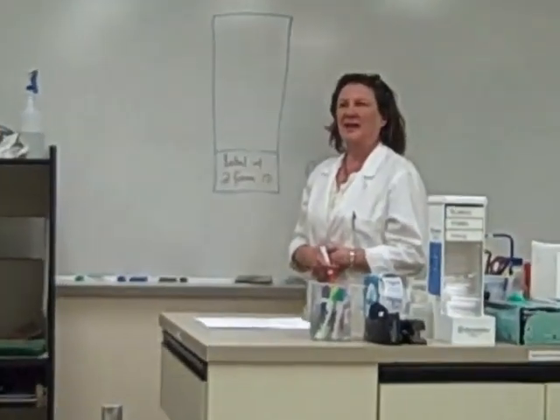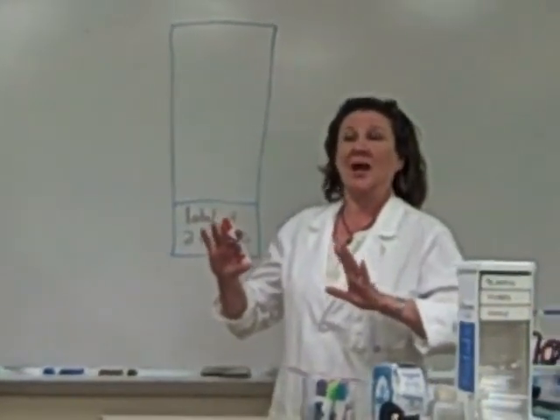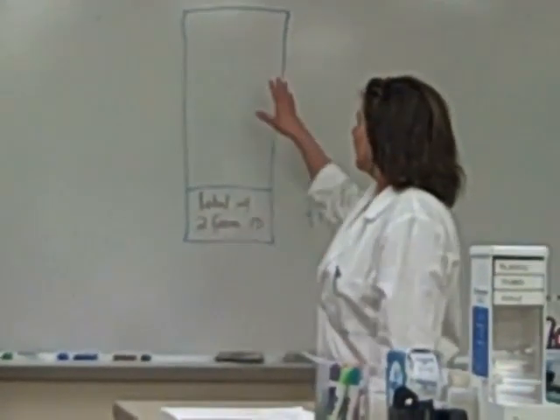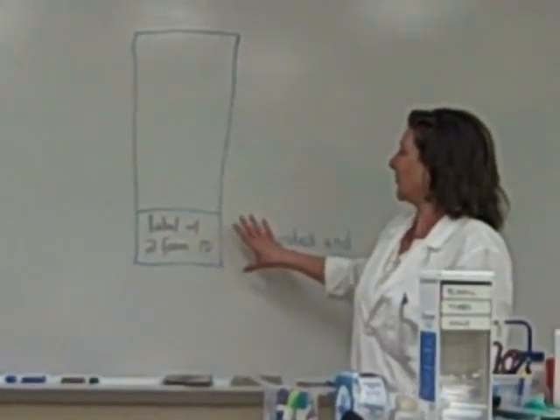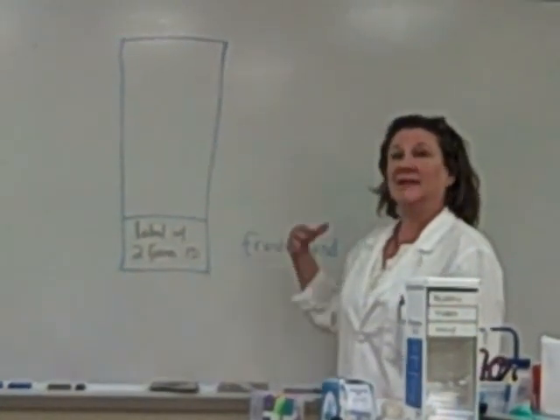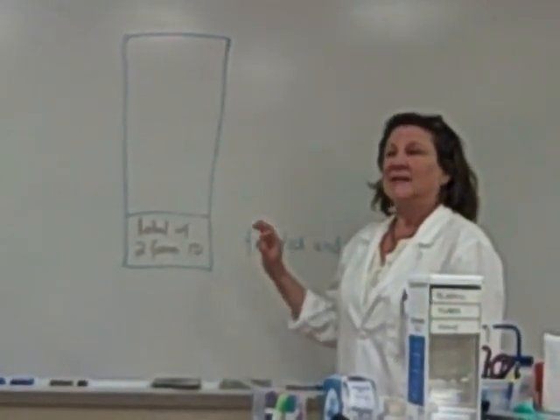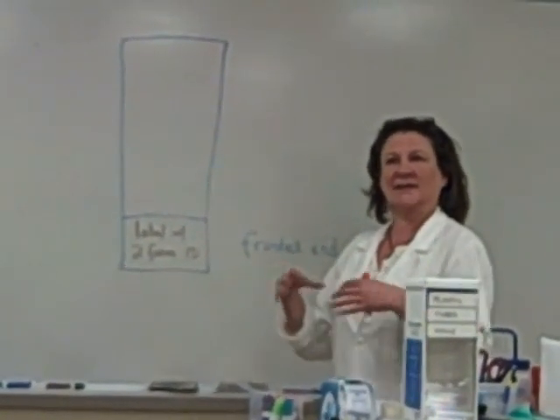Today we're going to be learning how to make the perfect blood smear. We're going to be working with the hematology slides. They have a frosted end at the bottom, and that's where you're going to be labeling your specimen. Today I'm not worried about labeling — it's just practicing the smear technique.